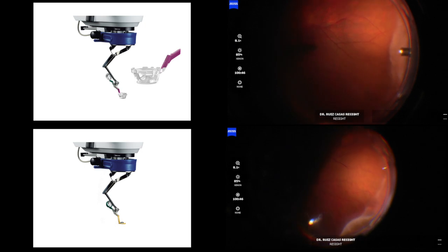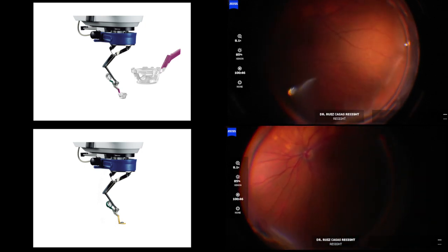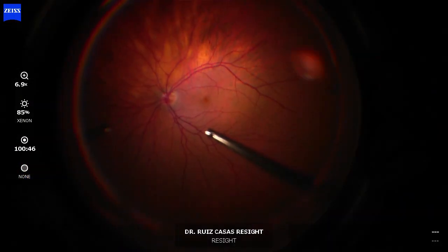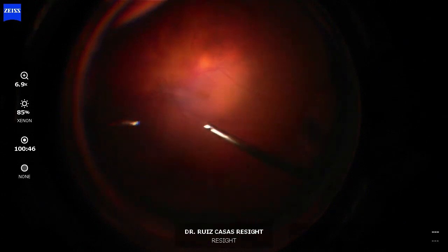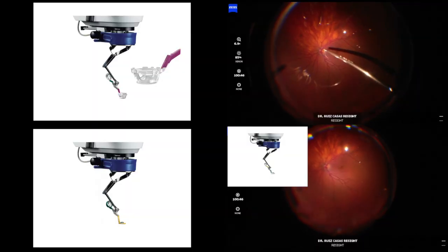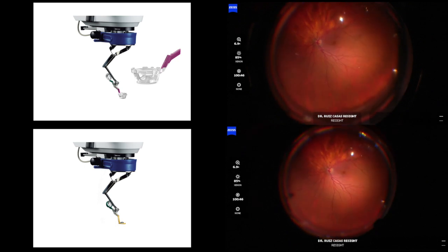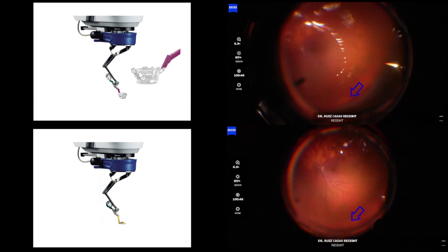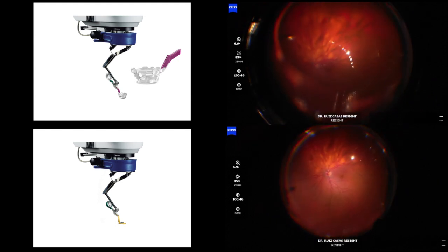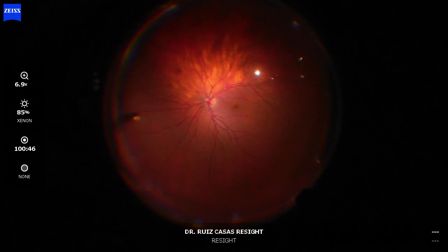As you can see now, I can check the periphery and perform the indentation in an easier way with the new ultra-wide disposable lens. Now I'm changing to air with the ultra-wide lens and you can see how peripheral I can reach — I can see the ora. But I can also reach the ora with the normal yellow one, so it is not that massive a difference. The massive difference is in primary position when you have this 10 degrees more of visual field.